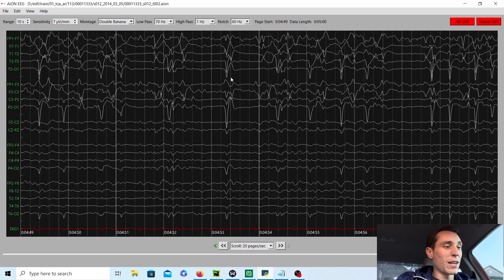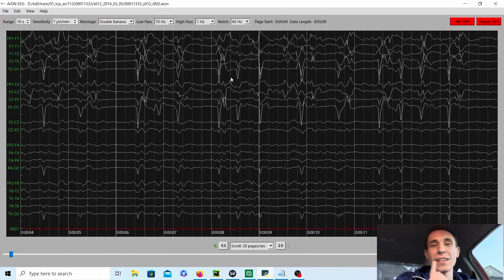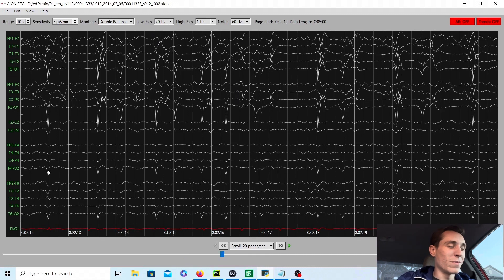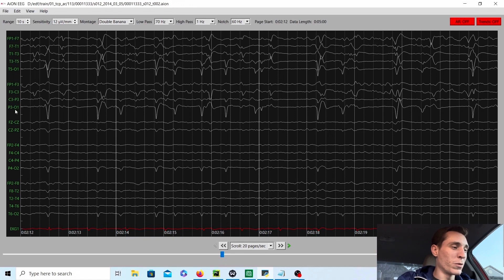As time progresses, if you're able to stop these epileptic discharges, the blue line will go back down to match the red line and they'll be a lot more even and symmetric. But right now, this is just completely happening nearly continuously and it's a medical emergency. You don't want to miss something like this on the EEG. You can tell that they're actually epileptiform because they spread — they have a field. They're most prominent in the O1 area, but O2 is right next to O1 and even though it's on the right side, you see a little bit of it spreading there. But it's definitely happening a lot more on the left side.